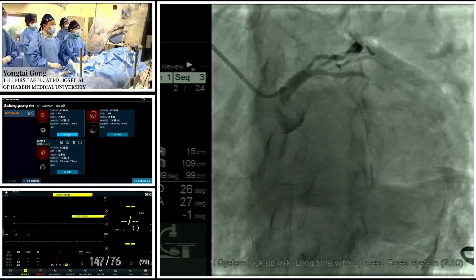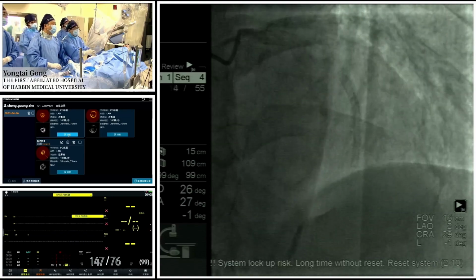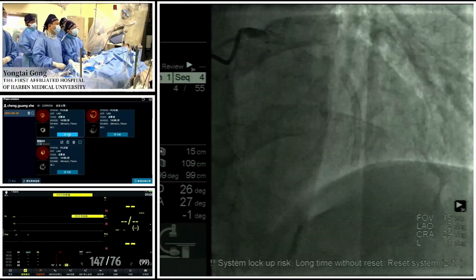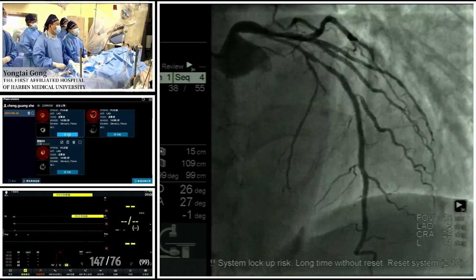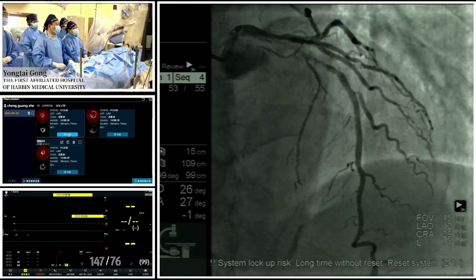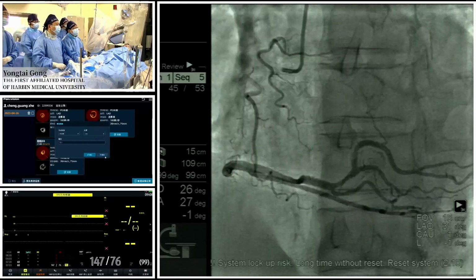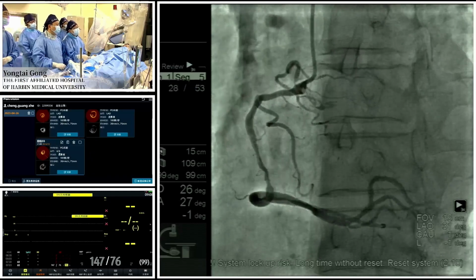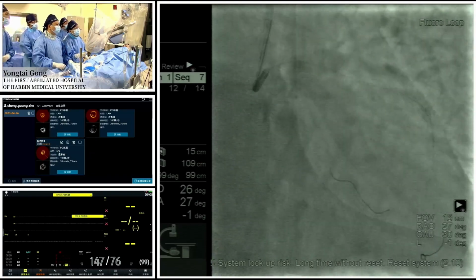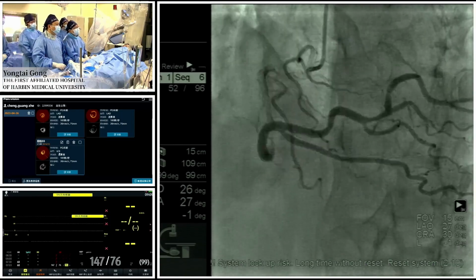At the end of the left main there is significant calcification, nearly 80% to 90% stenosis in the medial to proximal LAD, nearly 70% stenosis, and severe calcification in the medial to proximal RCA, nearly 50% stenosis in the proximal LCX.